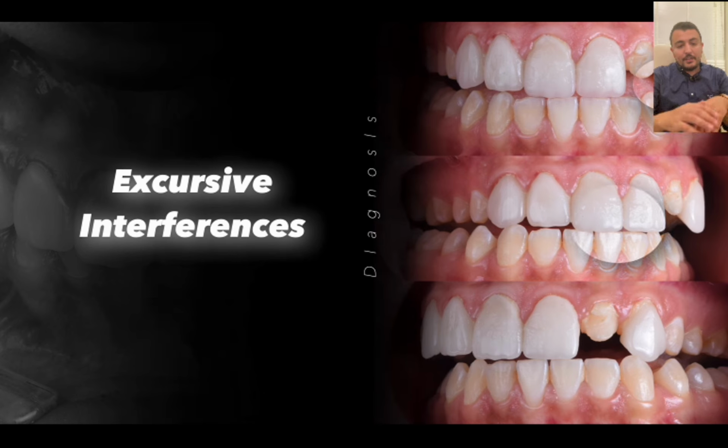For the lateral movement, we have two central interferences and we have a very large amount of disocclusion on the opposite side. Actually, according to Hobo, we should have around 1 to 1.5 millimeter of disocclusion at the working side and non-working side. Look at this photo, we have a very large amount of disocclusion, more than 3 millimeters, so we are placing heavy forces and severe loads on the TMJ leading to pain and discomfort. And the same for the opposite side, it's canine guided, okay, but we have a lot of interferences regarding the two centrals with a large amount of disocclusion on the opposite side, which is the non-working side.